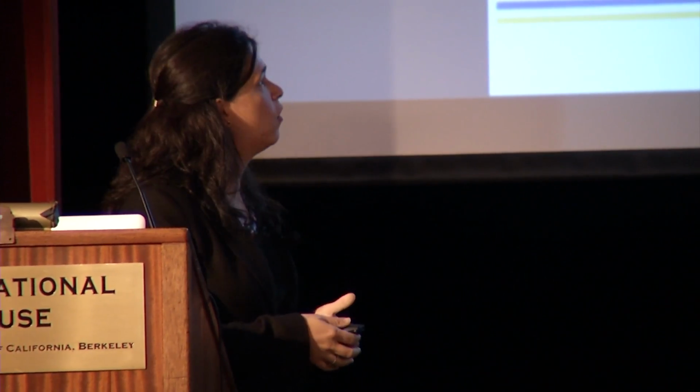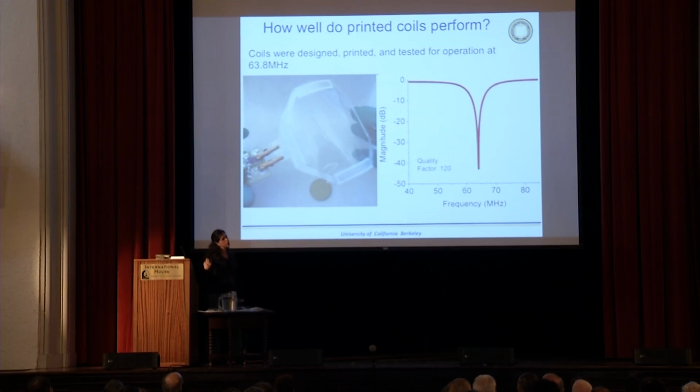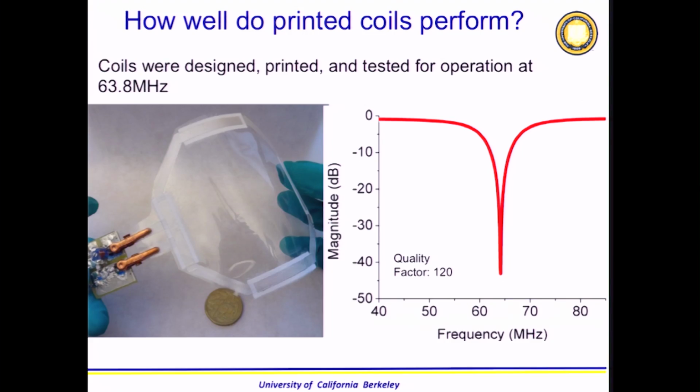How well do these coils perform? The first thing we have to do is connect them to the conventional electronics that is needed, and then we see if we can tune. This is the first thing that we have to do.